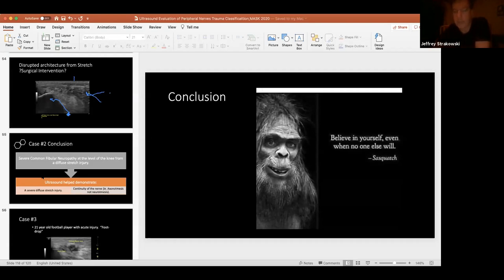And the same trick applies when we do these bifids, that people have to pay attention to. When we look at them again in long axis, we have to make sure we look at both segments if we're doing something like a carpal tunnel, any kind of tunnel entrapment in that circumstance.